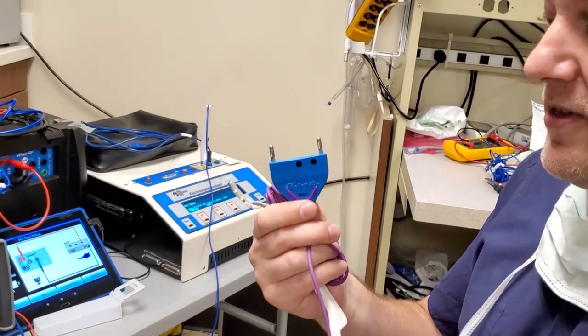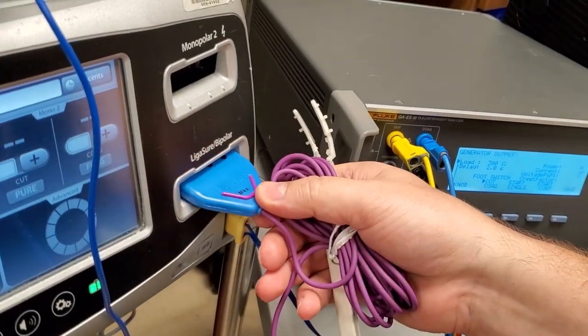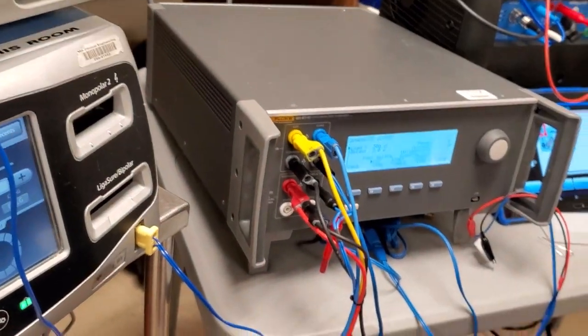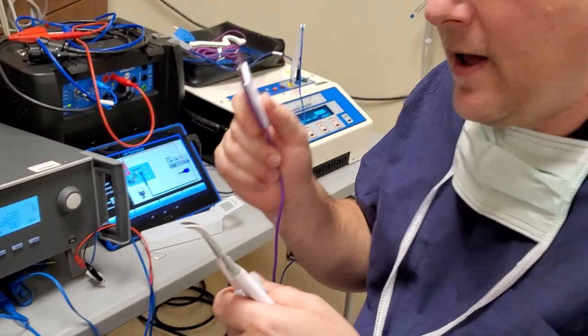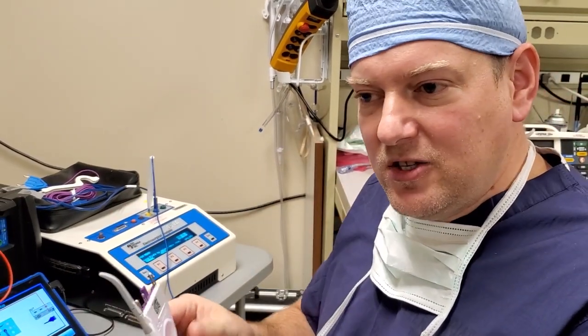Over the years the design has changed. This one here uses something called dot code — there are two dots here and there's a camera inside the port that picks up the dots and knows what handpiece is connected. As you can see it says 'unknown instrument' — this is an older one that works on Force Triad units but not the newer FT-10s. Inside, there's also an RFID tracker tag on some handpieces so it knows not only if the device has been used before, but what the handpiece is and what software revision is expected. If you get an error code, check the software revision — many times they come out with a new design piece and the software is not updated, so it reads it and says 'I don't know what that device is' and throws an error code.